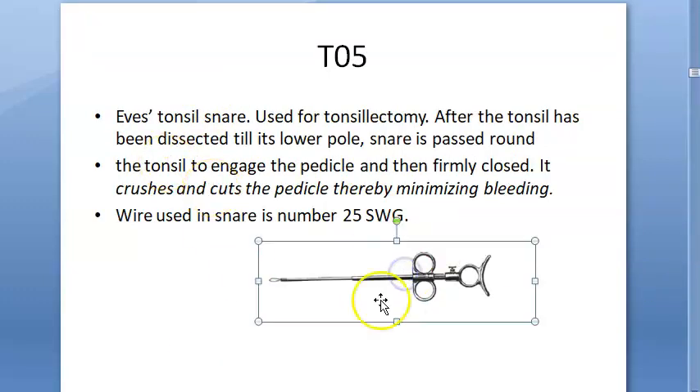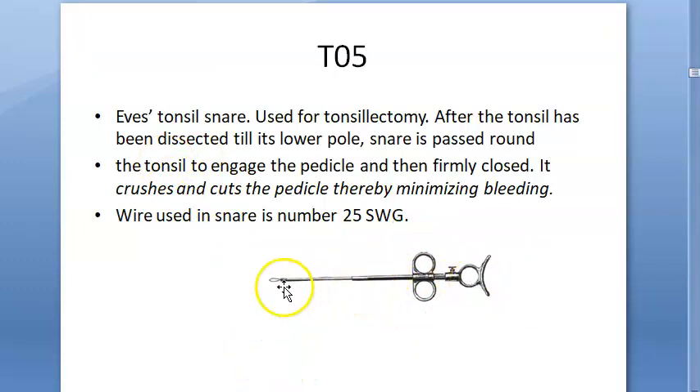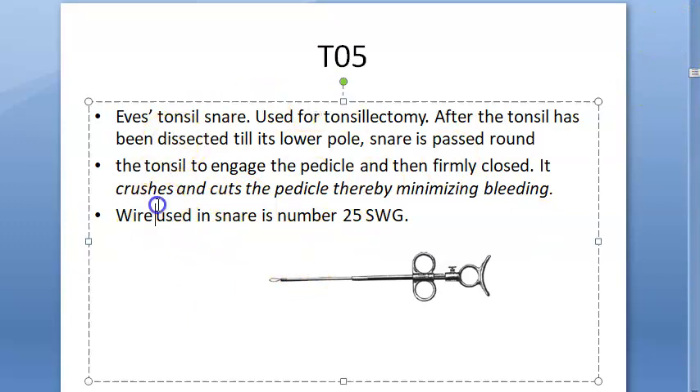Here you have the Eve's tonsil snare. You can see this — when you pull, the loop becomes smaller and smaller. It will crush and cut the pedicle, thereby minimizing bleeding. The wire used in the snare is number 25 SWG. This is the Eve's tonsil snare.